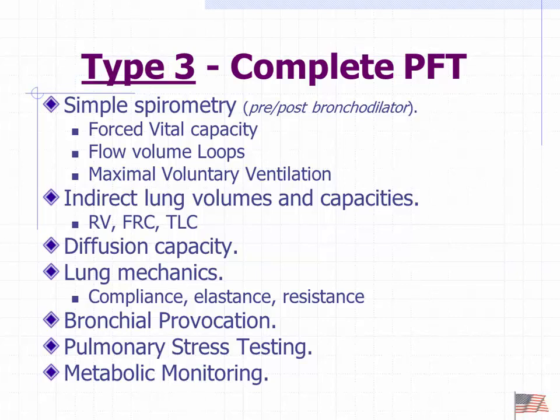Bronchial provocation. I don't know if Lori talked about that or not, but I'll go ahead and make mention of it. Bronchial provocation is where we suspect the patient may have reactive airways, may have asthma. We're not sure. They don't manifest the normal signs and symptoms of asthma, but it kind of looks like they may have it. So what do we do? We have them inhale a medication that induces an asthmatic attack. How nice is that?